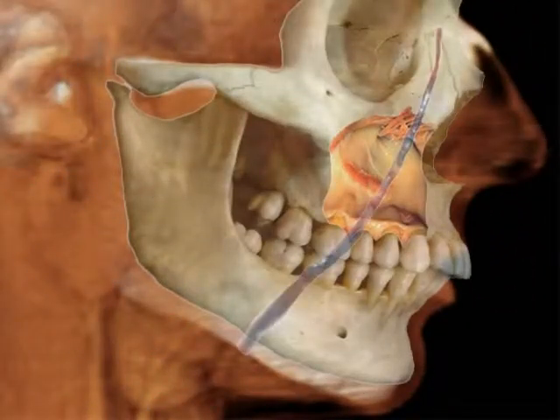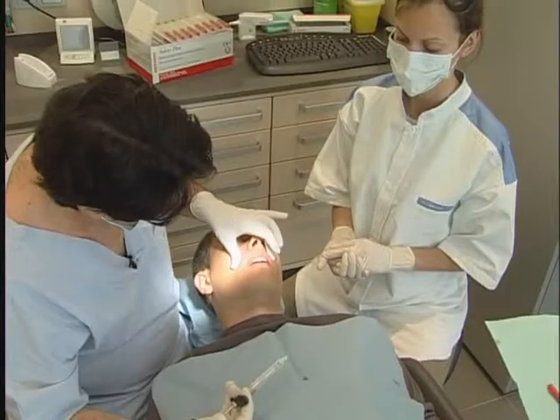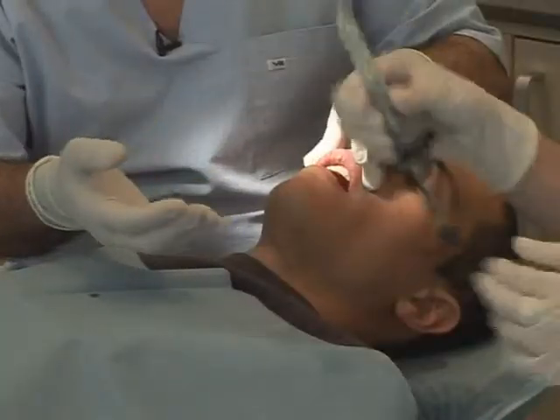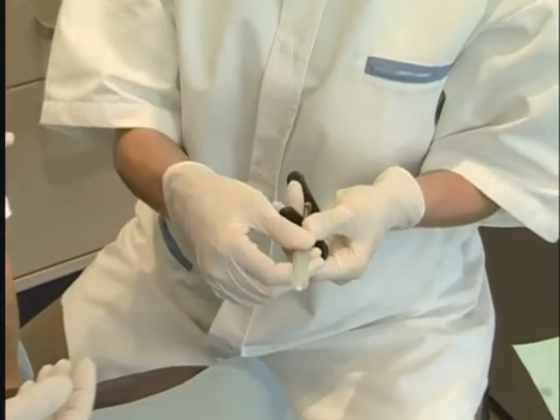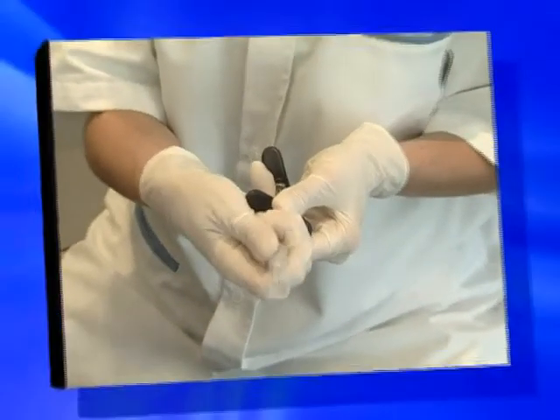Aspirate frequently as the facial vein and branches of the infraorbital artery cross this area. The frequently observed phenomenon of skin whitening seen after injection is explained by the crossness of these vessels. In some cases, analgesia of the two premolars can also be obtained by this technique.